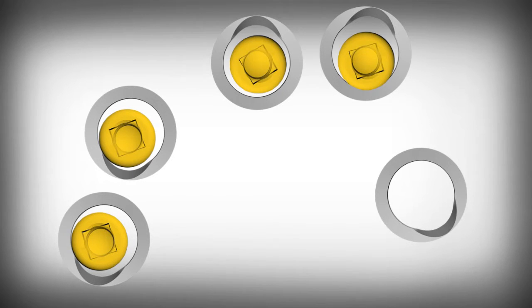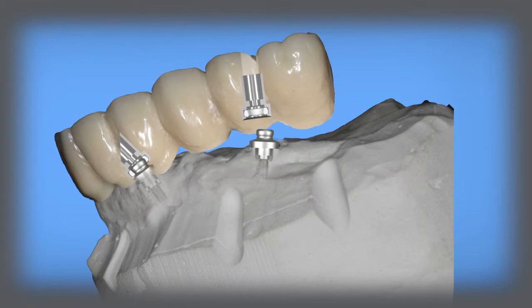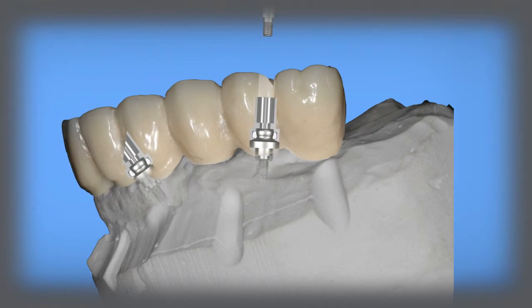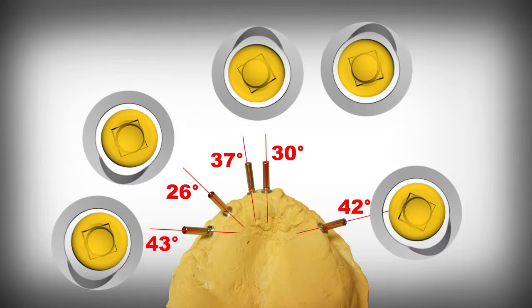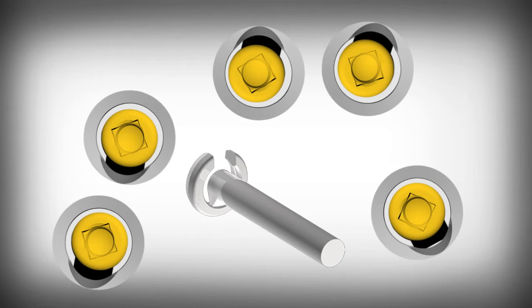To assemble the prosthesis to the divergent implants, tolerances are eliminated and space is created that allows some play and decentralization of the spheres to the perimeter of the cylindrical abutments, allowing the insertion of the bridge that exceeds the divergences of the spheres and is placed at the tip of the implants, despite the divergences, in a precise and passive position. With the OT equator biologic system, these noticeable spaces ensure passivation and are compensated by the elastic Seeger springs.